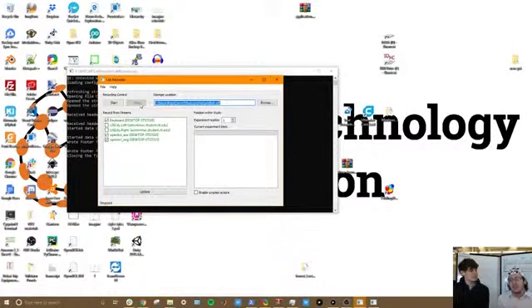So ideally what you'd like to do is find multiple different ways to create a stimulus so that the subject can get a sense for what's going on so that they notice which states, but at the same time you still have data representing when the events occur without having this kind of correlation between the sound and them actually doing the event. You want to make sure that you can separate those two things. So to do that, you would have to record this multiple times with different stimuli. But we're not going to do that here because we're not really interested in separating it that way. We're just looking to see that we can actually identify this at all.